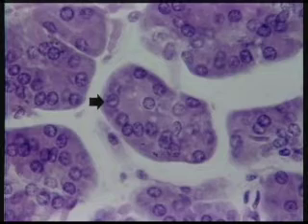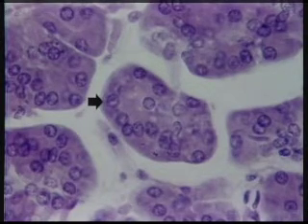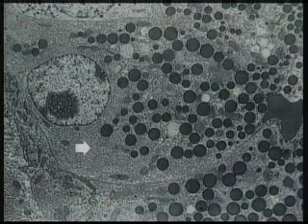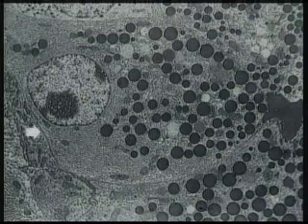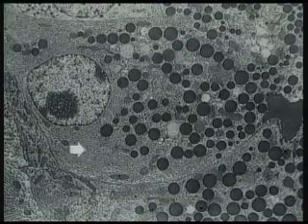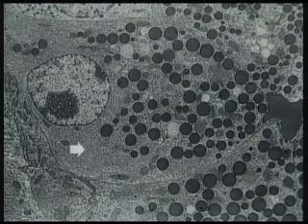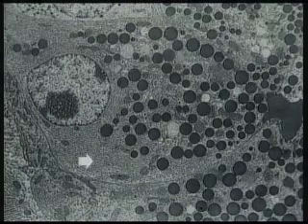Now, in order to see these components more clearly, let's look at the same cells with the electron microscope. This electron image here is taken from plate 1-1 in your visual histology text atlas, and it shows a pancreatic acinar cell. The basal pole of the cell is here, the apical pole of the cell is here. And in the basal pole of the cell you can see many cisternae of the rough endoplasmic reticulum, and this is what stains purple with hematoxylin in H&E preparations of these cells.